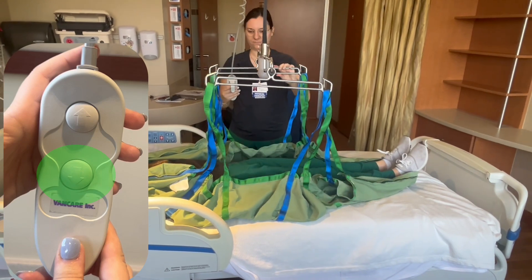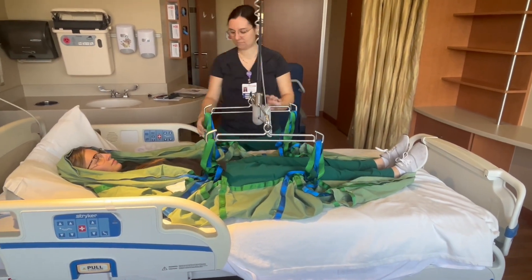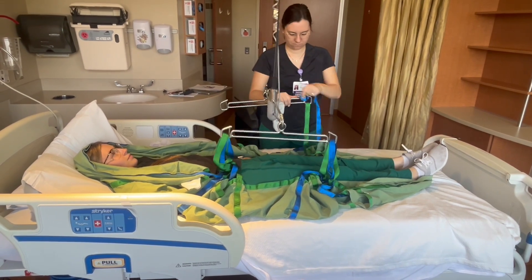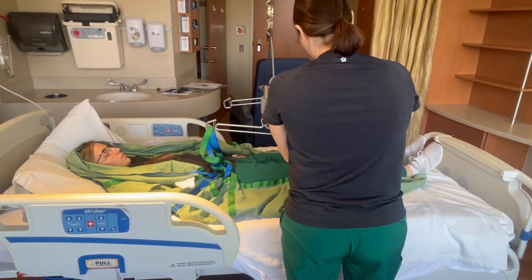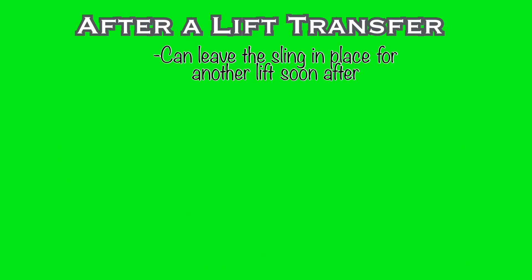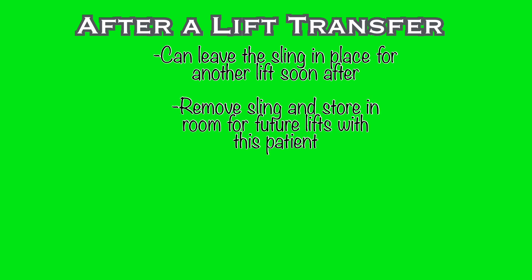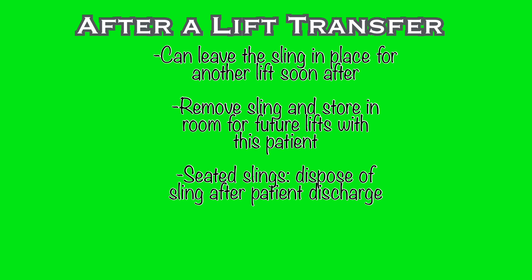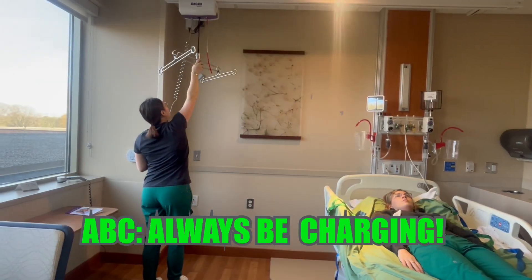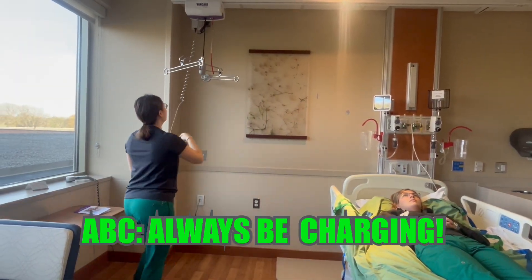When the patient is over the desired destination, lower the bracket enough to allow easy detachment of the loops, which have a spring-loaded locking mechanism that you'll need to open. After successfully using the lift, it is acceptable to leave the sling in place if you plan on using it again soon. Otherwise, remove the sling and store it for continued use with this patient. The seated slings are disposable and should be thrown away after the patient is discharged or if they are soiled. The green supine slings are to be laundered. Lift the bracket back up and swing the lift to the corner to dock it with the charger.